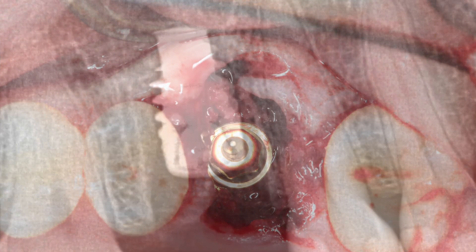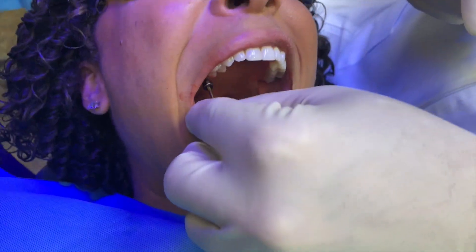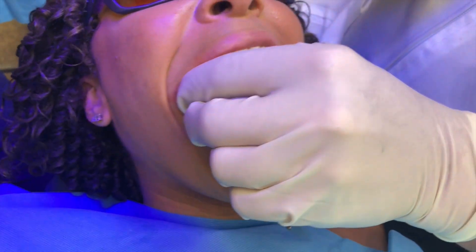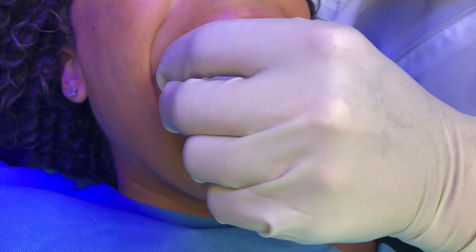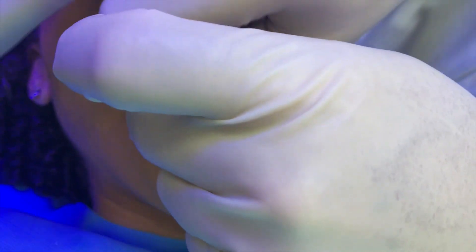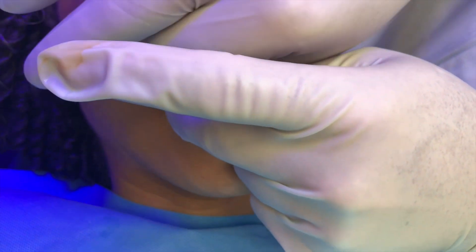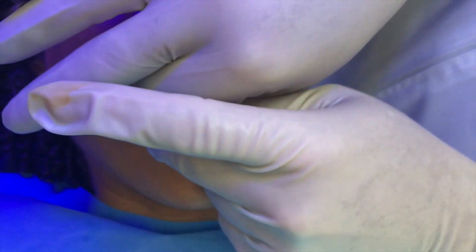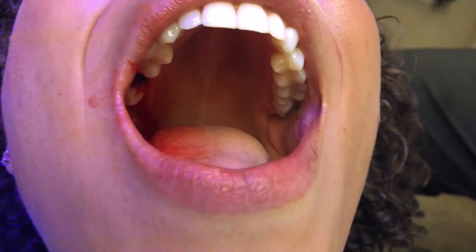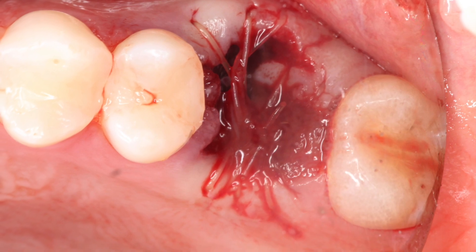We didn't achieve very high stability — about 20 Newtons — so we're going to leave a cover screw on, come back later, and fix this up after healing. This is quite common and everything works out fine. We'll put the cover screw in place — an X-ray was taken after that — then put a few sutures in to keep blood over the top and prevent food from collecting, giving a good surface for healing. The patient doesn't usually experience any pain, so it becomes very easy. This is Dr. Scott McLean, and this has been the McLean Experiment.